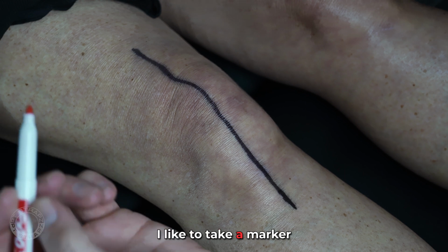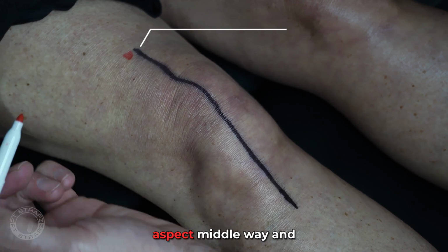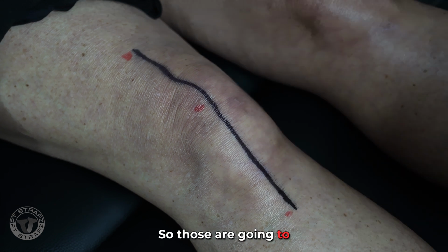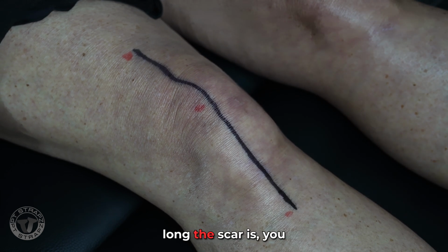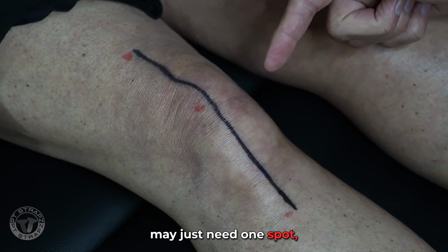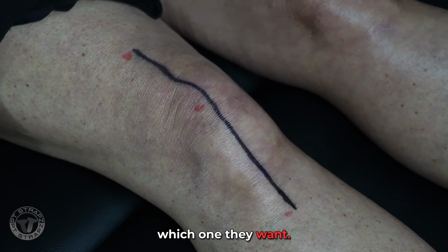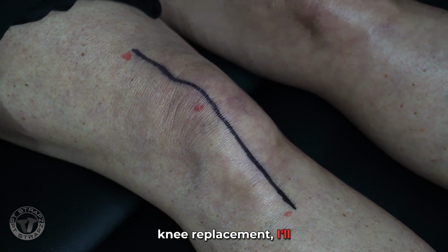What I like to do is take a marker and mark the superior aspect, middle way, and the inferior aspect of the scar. So those are going to be my landmarks. Now, depending on how long the scar is, you may just need one spot, you may need two spots, but that's up to the clinician determining which one they want. But for a typical total knee replacement, I'll use 3 points.